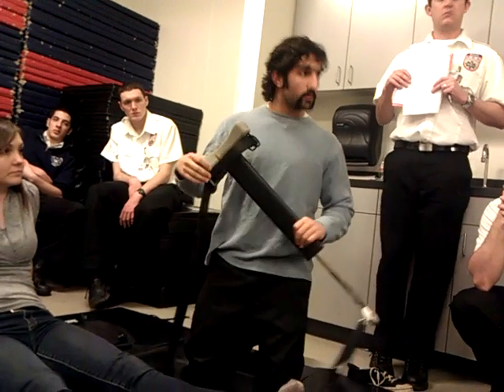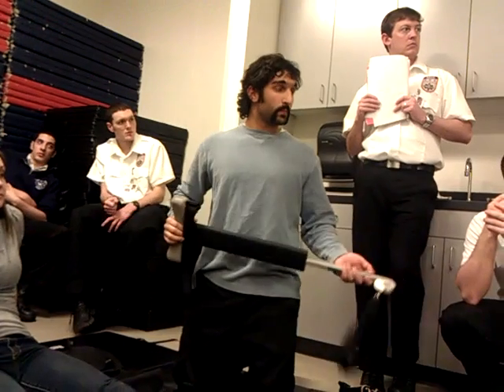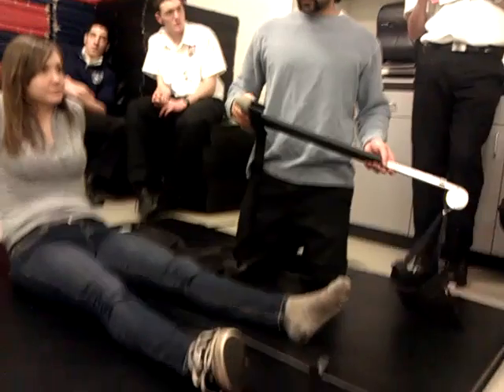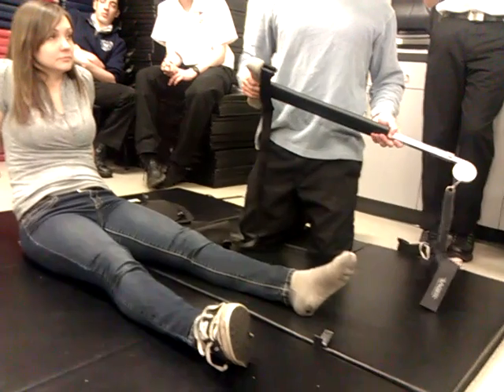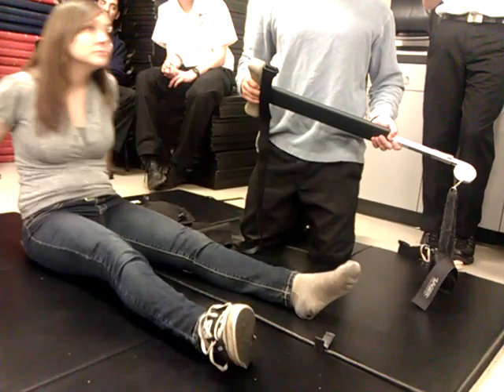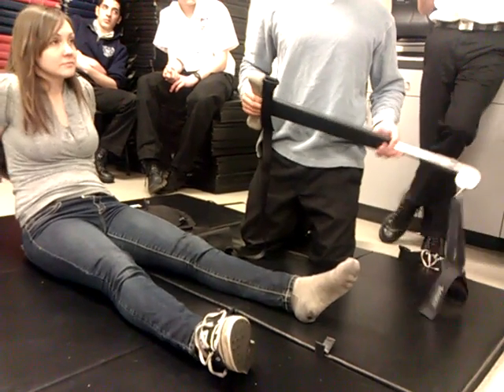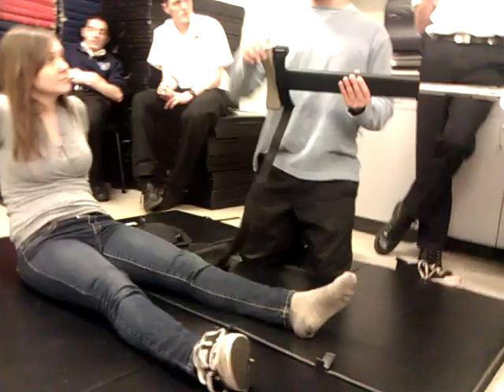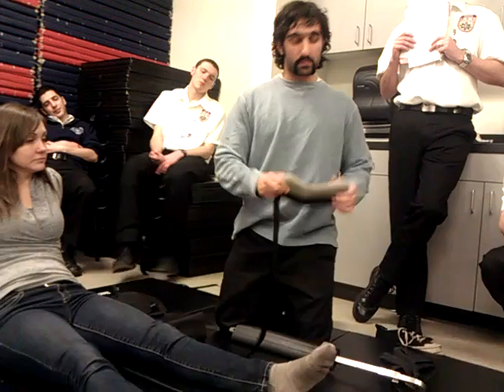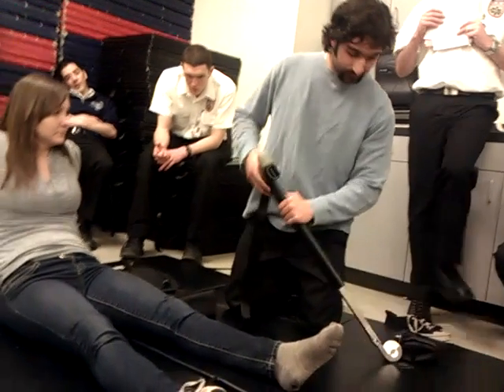Okay? Guys, please don't come back in like 3 months and not know how to do this. We'll switch the leg when we do the finals, so you'll have to know how to switch that on the device. Please don't come in and say, I really don't know why it's not working. It's really simple. It's always outside, the D-ring's always on top. If you want to switch it, flip it around, and this thing is bendable to accommodate for the left. Alright, so for this instance, we're going to say the left leg injury.